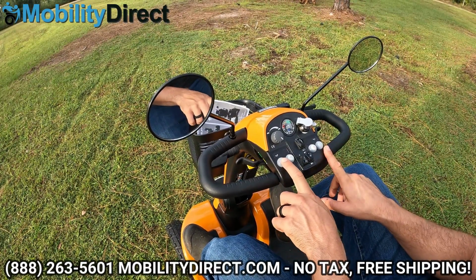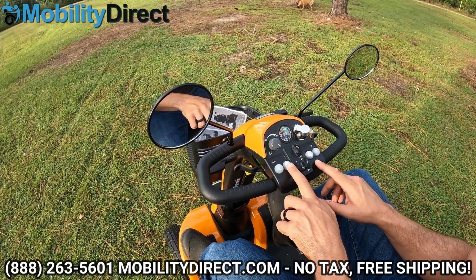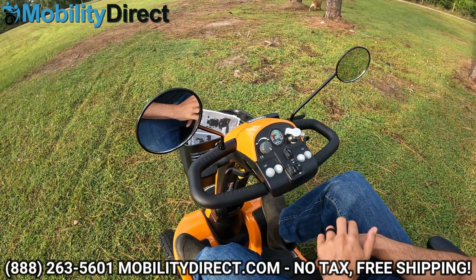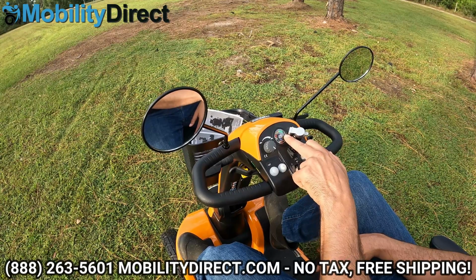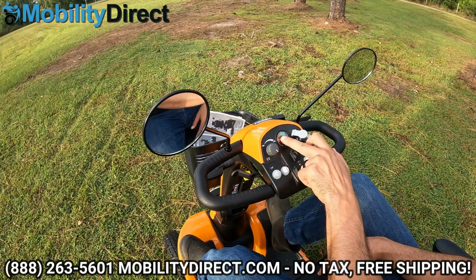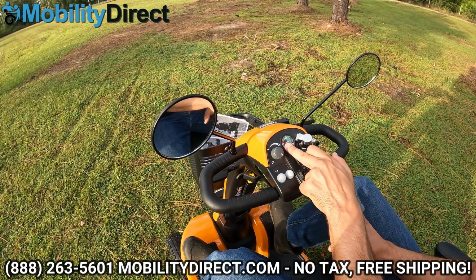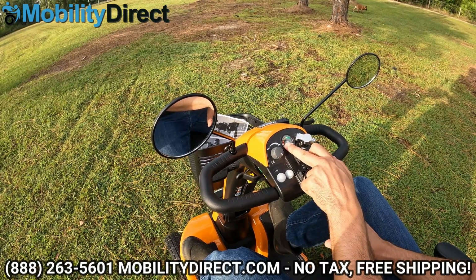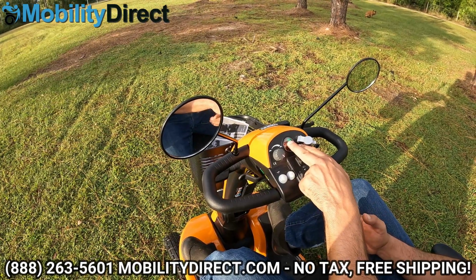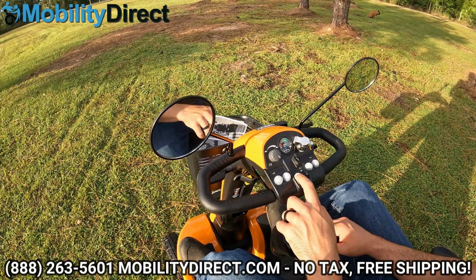We've got a horn, which is just a buzzer. It's not too loud and obnoxious, pretty nice. You've got your left and your right turn signal. Very easy to read battery meter. So you can see we've got 2 of the green LED lights turned off. The battery is draining. You want to make sure you charge it when it gets close to the red. Don't let it get all the way to the last red. That's not a good practice. You're not going to get the longest life out of your batteries if you do that. The best practice is to top it off when it gets down to the first yellow or the second yellow and charge it overnight.